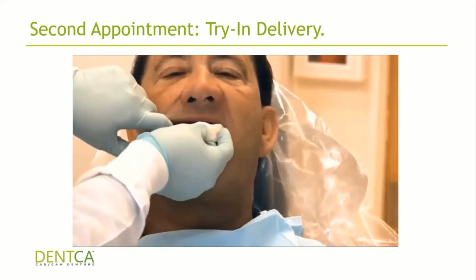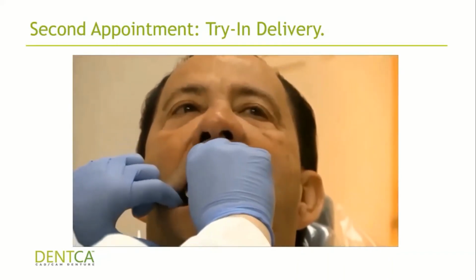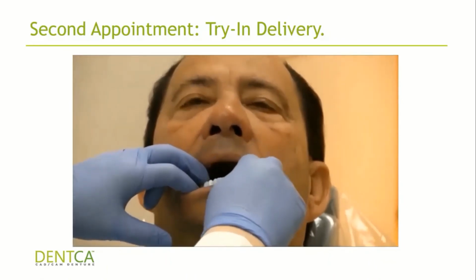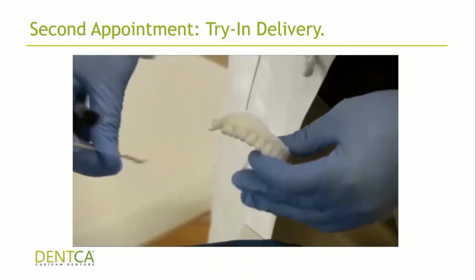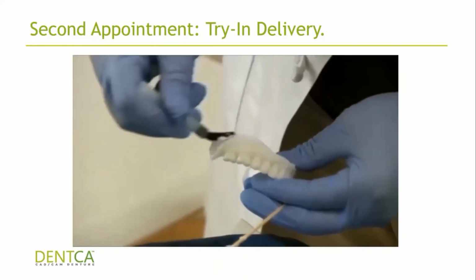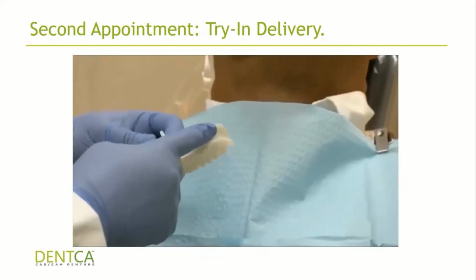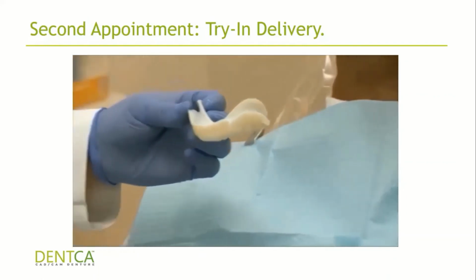So first thing, as we mentioned, is to make sure that the denture is sitting all the way. If the denture is not sitting all the way, sorry, then do not evaluate the bite because the bite will be incorrect. So in this case, there was a little bit of an area that was hurting the patient in the posterior left. So they applied PIP paste and they ground the lingual borders a little bit.